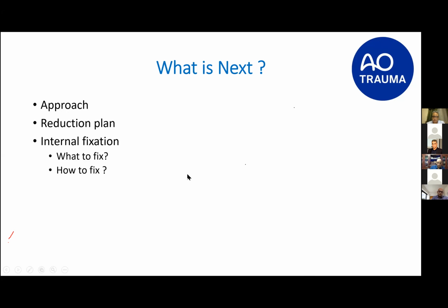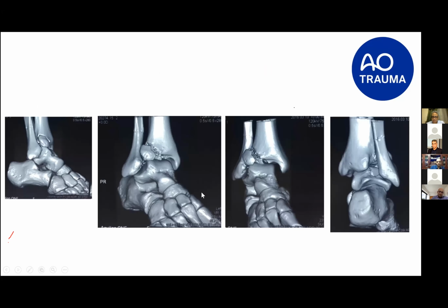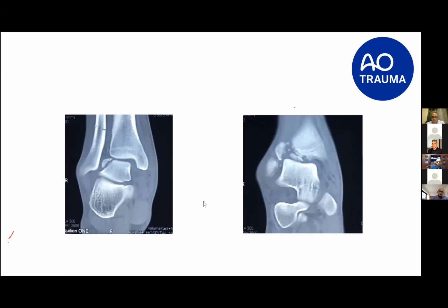It has taken out the anterolateral fragment and it has comminuted that part, as you can see from the CT. And in addition, it has caused a shear fracture on the lateral side of the talar dome, as you can see from the CT here. Now, this impaction fracture with a lateral deviation has definitely caused small loose bodies to be intra-articular. The incidence of seeing these above the talar dome, open, is much, much less than if you have introduced the scope and you can actually see and pick them out.